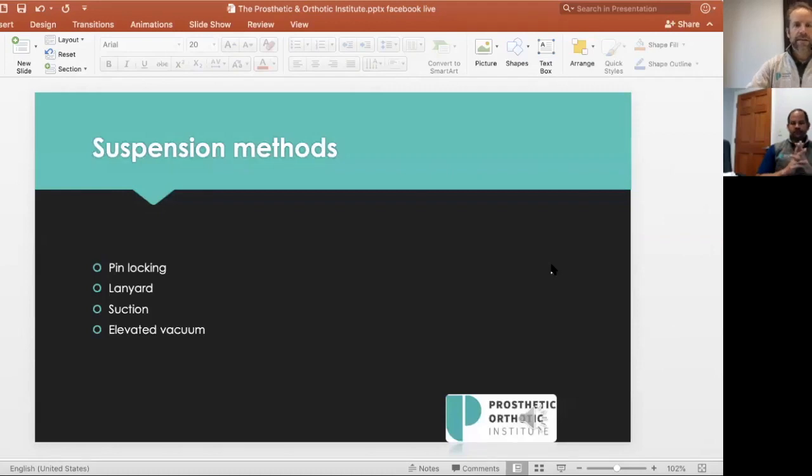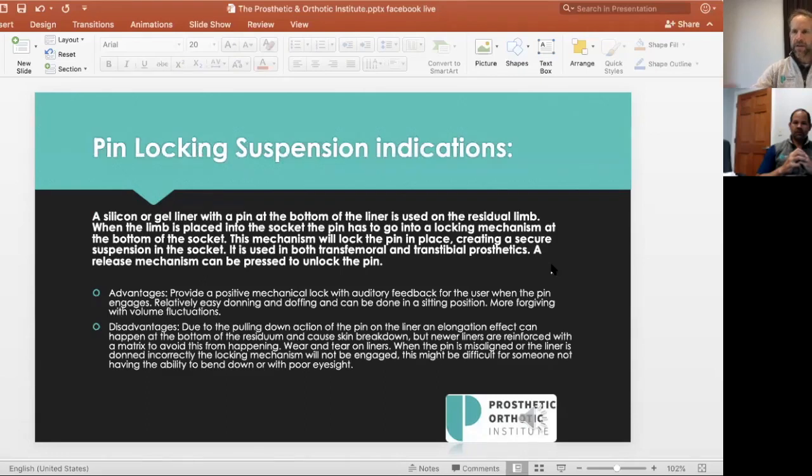All right. So now we get into suspension. We talked about pin locking, you mentioned pin locking, the lanyard, suction, and elevated vacuum. So a lot of words here, but show us and talk to us about the pin locking.